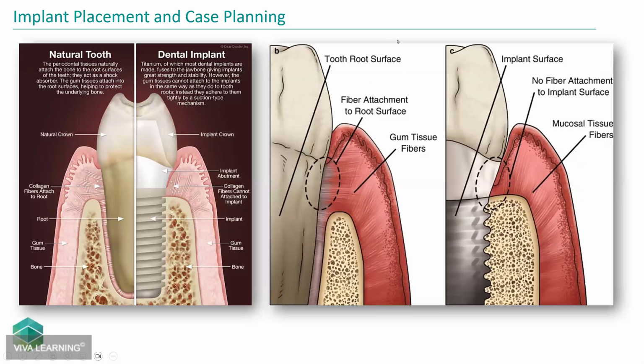So to understand that from the beginning, we have to realize that dental implants are not teeth in the regard that teeth have a periodontal ligament, some cushion, some movement. Dental implants are osseointegrated into the bone, and they are completely rock solid. They don't have any compression upon bite. The periodontal situation around the tooth is very different.